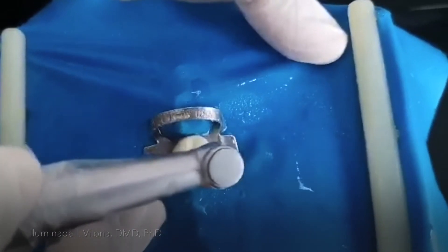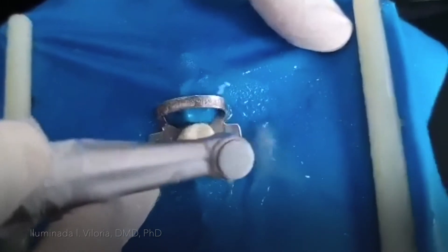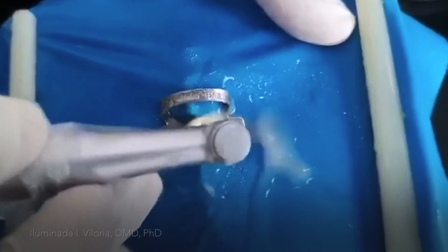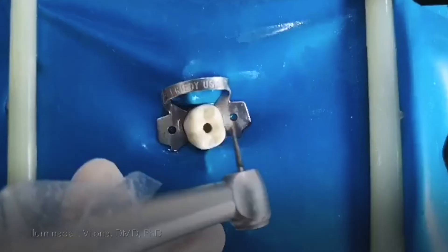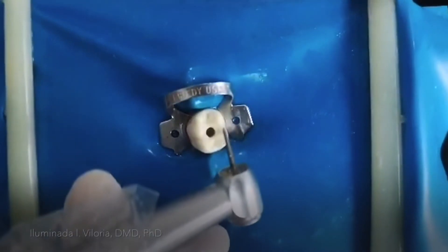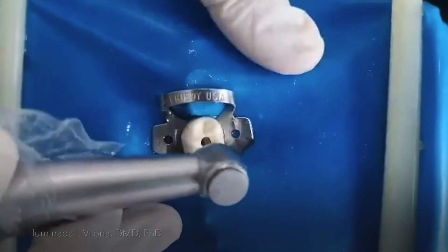Try to feel if there is some touch using this one. While you're still working on it, just continue to use this round burr with an outward stroke. Now I have changed my burr into a long tapered fissure burr, so I'm now going to smooth the walls.